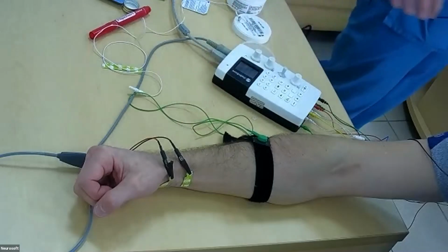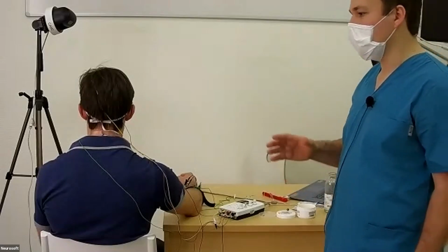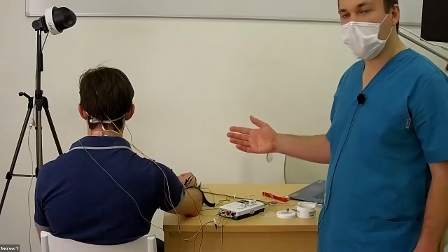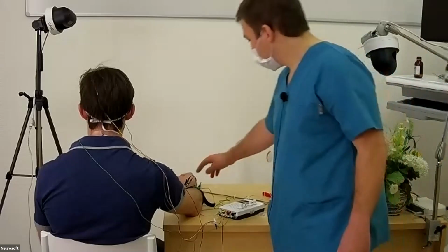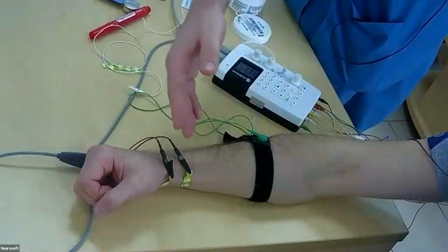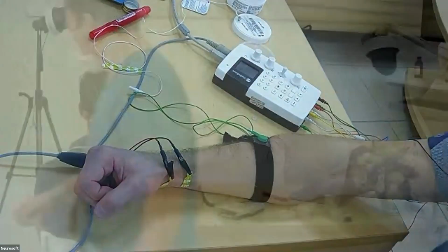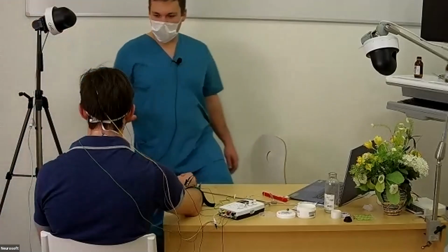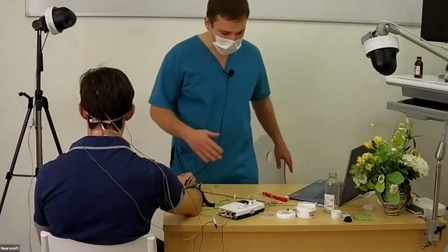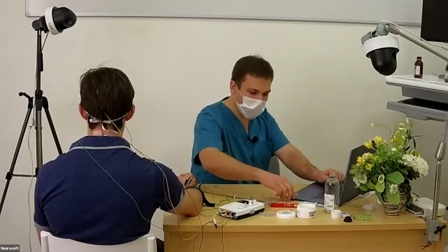For stimulation we use averaging of about 100 to 500 stimuli, so we need constant stimulation. It's better to use adhesive electrodes than classical bar electrodes. So we have prepared everything, and now we can open the methods in the program.